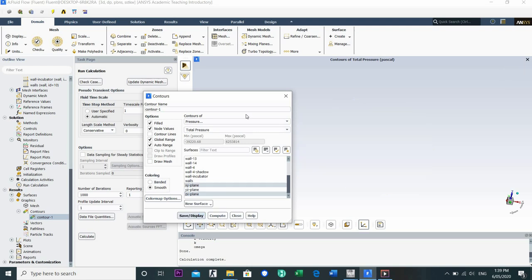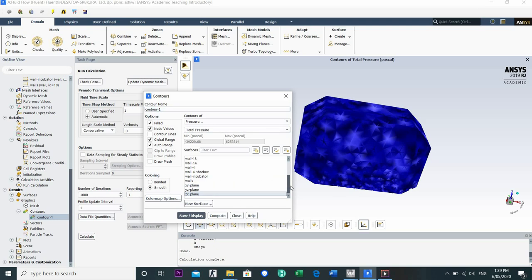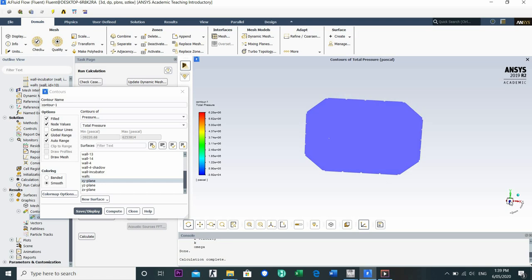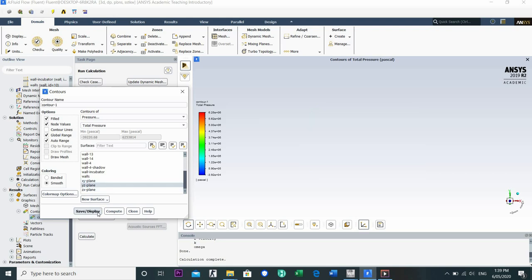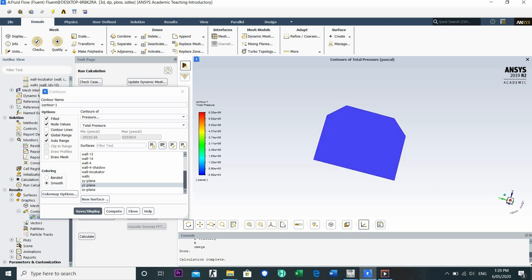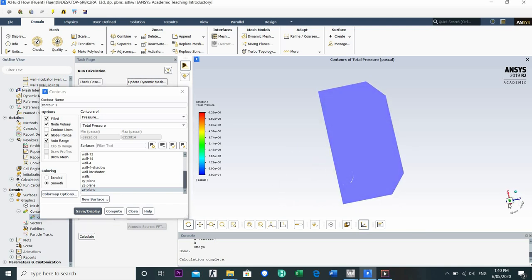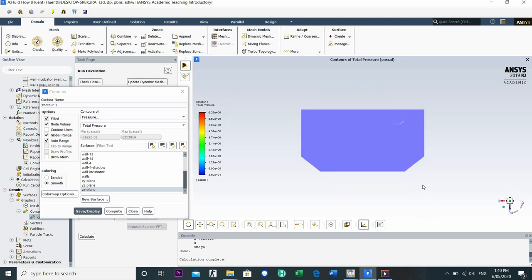Then from here we can see, oh sorry, we need to uncheck this, then check this, and then go to this one. Okay, we got this color. It's around here. I don't know why it's getting like this, but its color is this, so it's true. And then the next one is this. Oh, here we go. So you can snip all of these, and the ZX looks like this. Okay, I think it's already done.